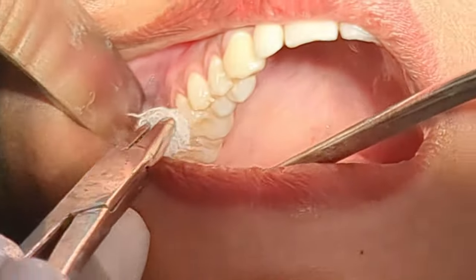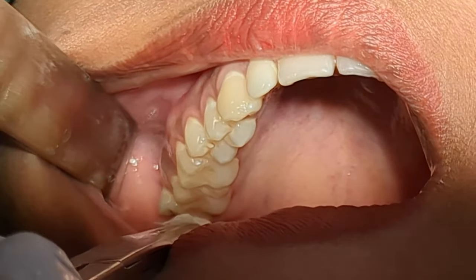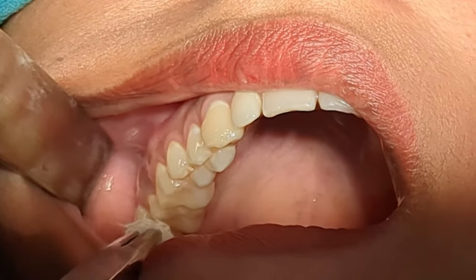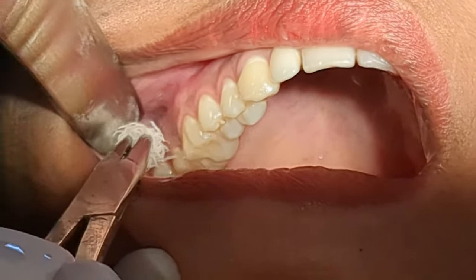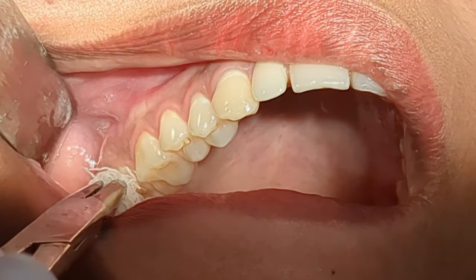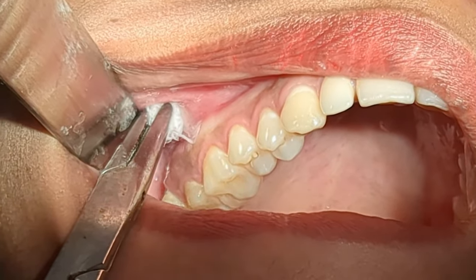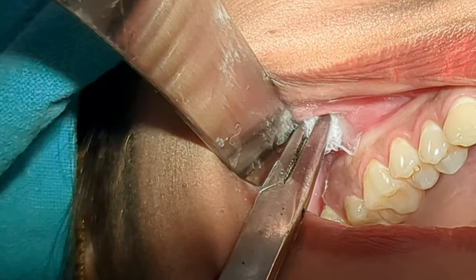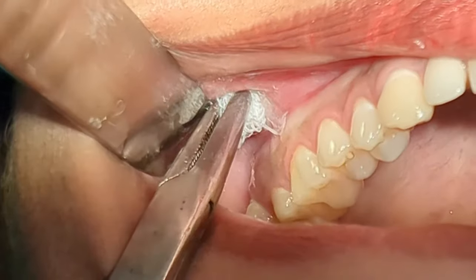Just remember the key landmark where you want to insert the needle for PSA — at the depth of the mucobuccal fold at the apex of the second molar. This is the second molar. The depth of the mucobuccal fold is here, and I am going to apply pressure with the topical anesthetic soaked gauze like this.